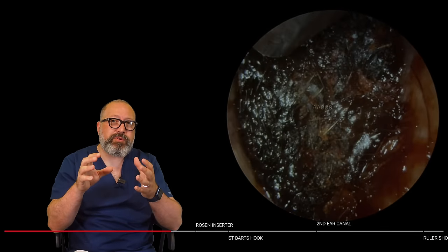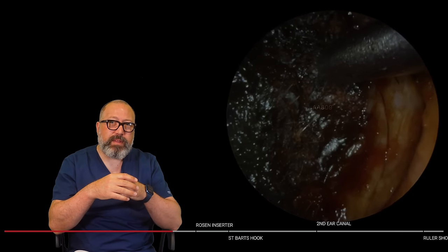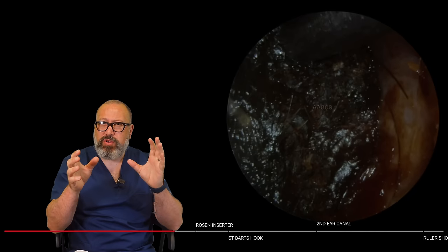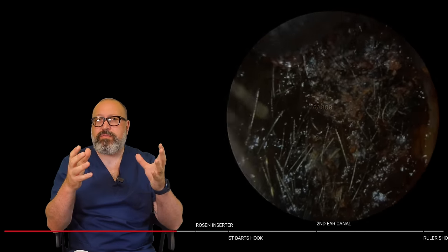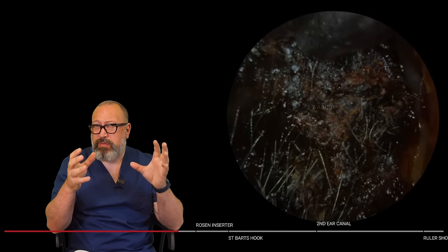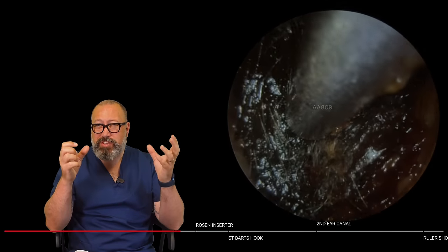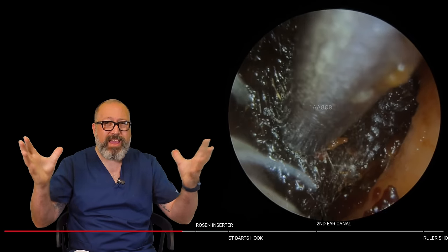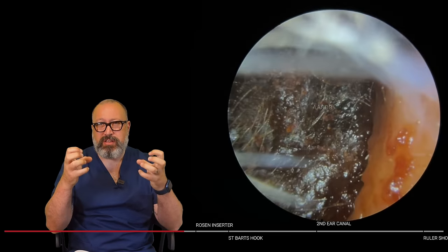So what we're doing here is we're just pulling this forward slightly. That's not quite, there we go. Now we've pulled it forward. Now we're away from the eardrum. It gives us a little bit more leeway as to how much movement we can put onto this wax plug, because it's not going to be pushing against the drum anymore. But you can see just how dark this plug is, how old this wax is. It's just absorbing every inch of light that we're putting into this ear canal. It's all getting sucked up by this wax plug.